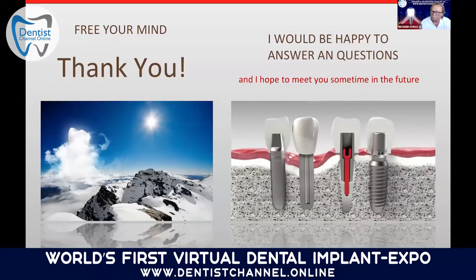We do that in a large number of cases. In the United States, for a good 90% of the cases, we actually do individual gingival formers for each case. In Germany here, we're about 50-50: 50% doing gingival formers in single stage surgery, and about 50% doing two-stage. But I am a strong promoter of doing an immediate gingival former, especially individual gingival formers that match that tooth area.